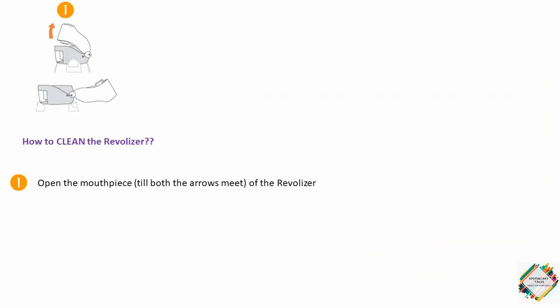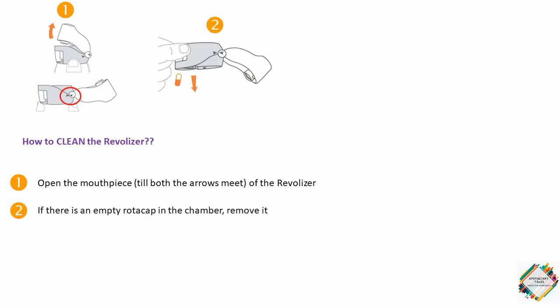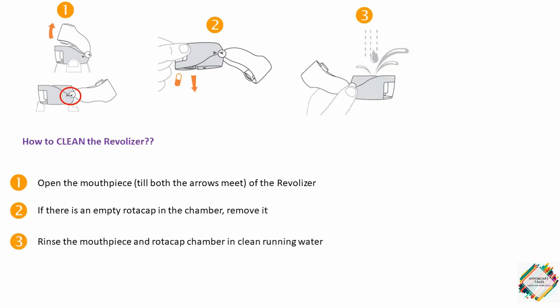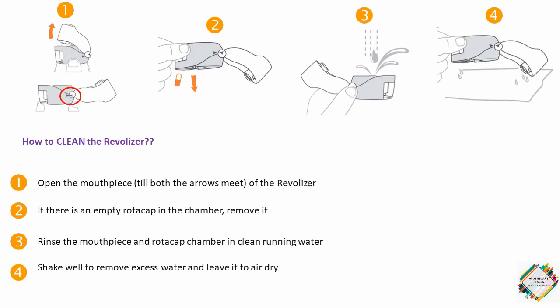To clean the Revolizer: open the mouthpiece until both arrows meet and remove any empty Rotacap. Rinse the mouthpiece and Rotacap chamber in clean running water. Shake well to remove excess water and leave it to air dry.